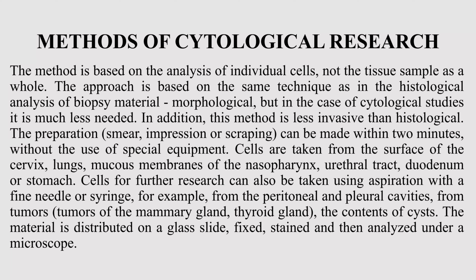This is probably easier than usual histology. This method is used for smears from gynecology, from the upper respiratory tract, and for liquids from the abdominal cavity and pleural cavity. It's liquid which contains individual cells, not solid tissue.